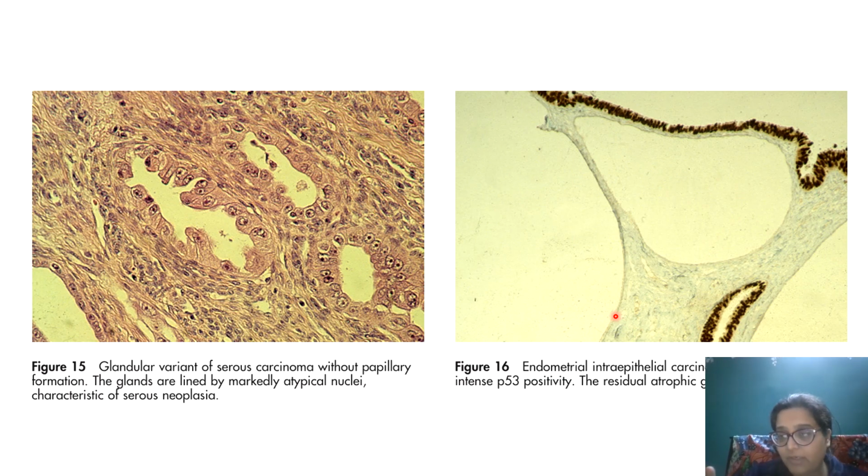These are cell cycle regulators. They are not mutated proteins. They become mutated because of something, but they are naturally present in the body, as compared to acquisition maybe of some protein due to a virus like HPV. P16 is a cell cycle inhibitor which gets affected by HPV. But if I acquire a protein which is normally not there in my body, then that mostly comes out as a marker of tissue. Supposing I go for a leiomyosarcoma, then you say SMA, smooth muscle actin.